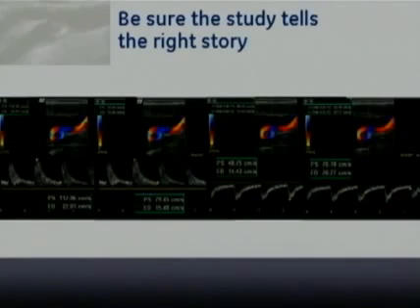You update the image, double check the location of your sample volume, and angle correct to the walls as it curves around. It's challenging to do, but make sure that the velocity values make sense. And sure enough, when I do this, my velocity is 70 centimeters per second, and that's more accurate. So in reality, in this coil, my velocities ranged from about 70 to 80 centimeters per second, never from 70 to 112, just down to 48.